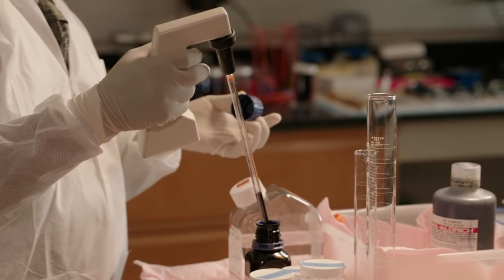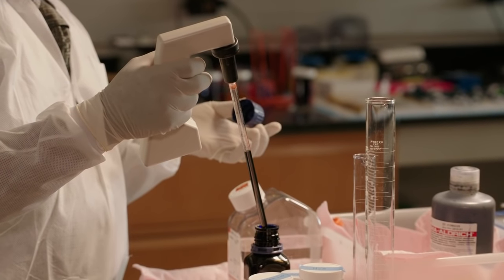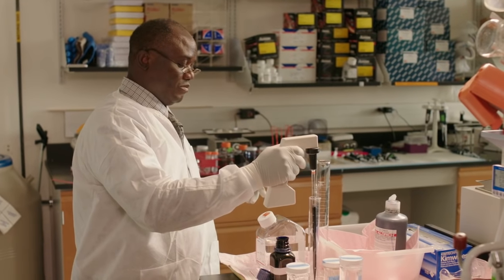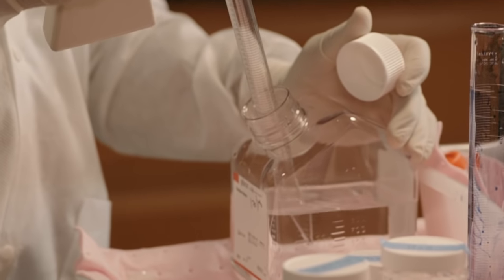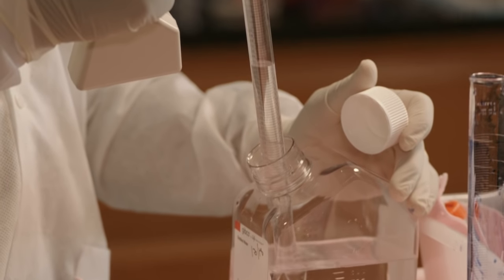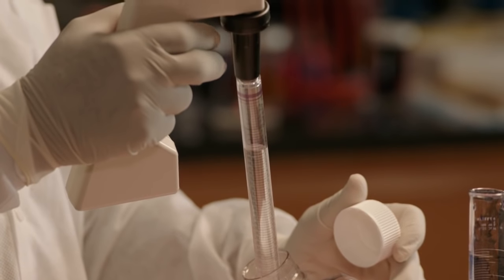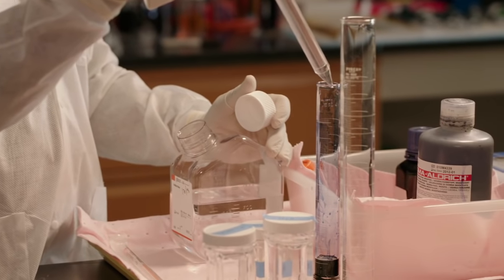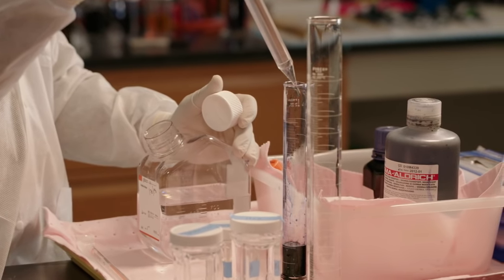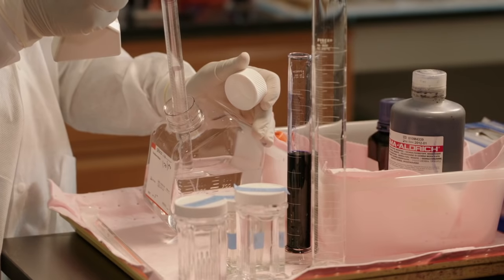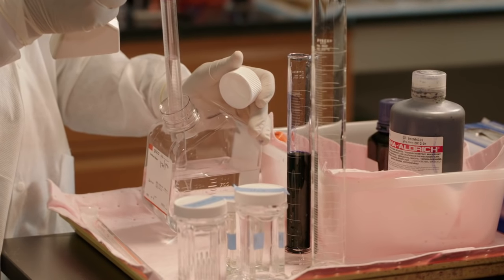We are going to prepare working Giemsa stain. You will take 10 milliliters of the stock Giemsa stain and then you add 90 milliliters of buffered distilled water to make a total volume of 100 milliliters. This is a 50 milliliter serological pipette. So I'll prepare 50 initially, and then add 40 milliliters. This comes to a 1 in 10 dilution of the stock Giemsa stain.